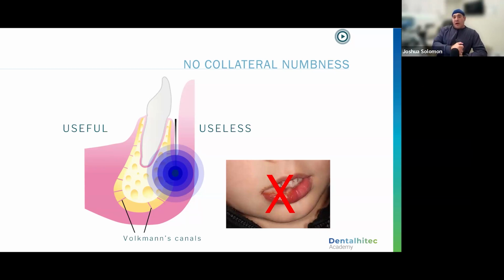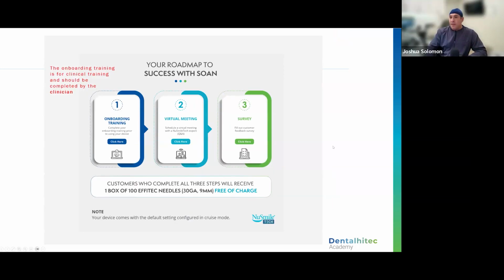I will tell you, when I've talked to doctors that have experienced that, it was because in that first stage they were giving too much local, right? And we'll go into detail about that, and I'll show you the stages of how we administer an injection. But if you follow the steps, if you follow all the rules, you should not have a numb tongue or numb lip afterwards.